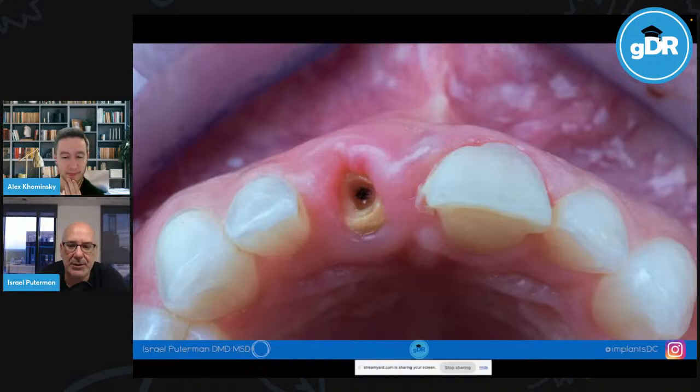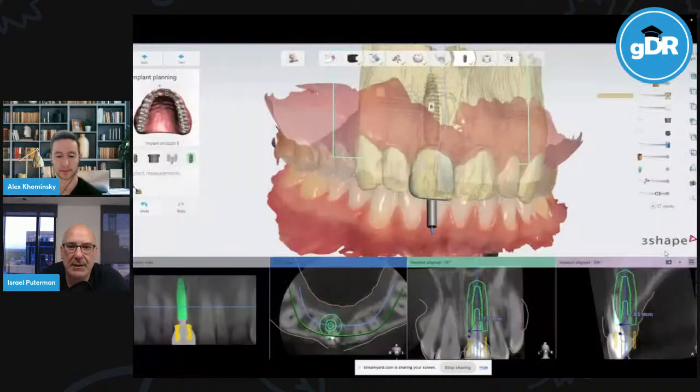And I'm a periodontist, so I'm not sure how it works in Australia, but I don't restore any cases. I might provisionalize cases, but I don't make any final restorations. I work as a team with a restorative doctor. It's fairly simple. Same thing? Yeah. Okay, good. So you look at it from the occlusal standpoint, I can still appreciate the thickness of the tissue. I see contour. This looks like a slam dunk to me.